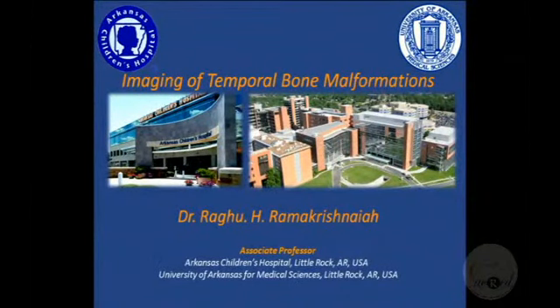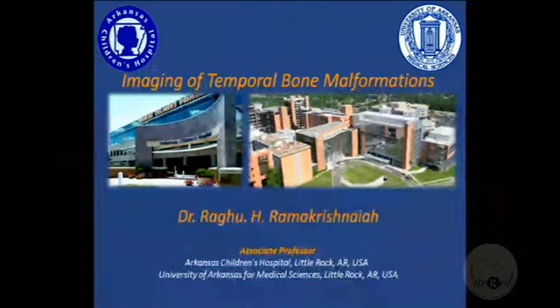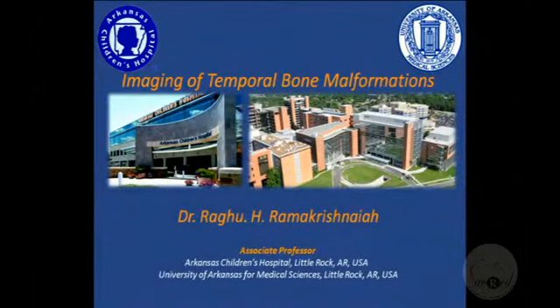We did the pituitary topic, and the other area my residents are a little bit uncomfortable with is temporal bone. That's the reason I picked two topics which were slightly complex or subtle, and just wanted to elaborate on that one. Before I start this session, I just want to get an idea about what you practice so that I know how much to stress on different levels.